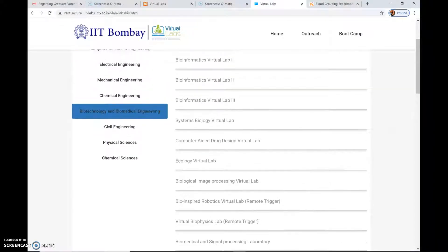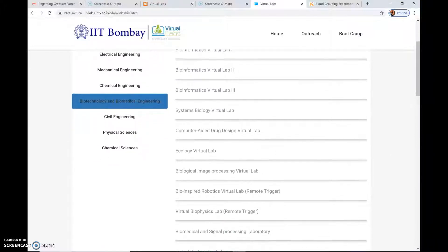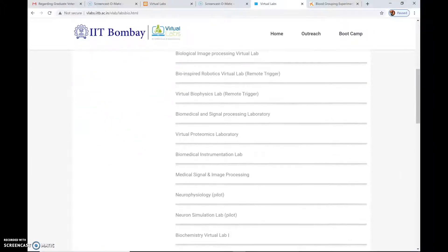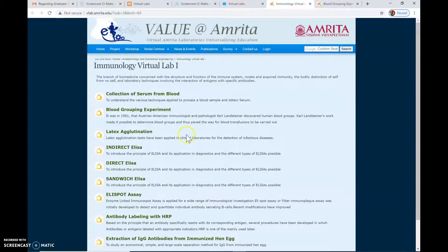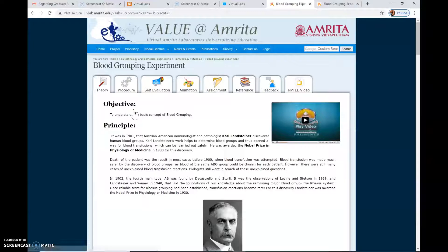which is Immunology Virtual Laboratory One. Click on this and you will see the experiment — Blood Grouping Experiment. Let's click on this. Now here is a virtual experiment regarding blood grouping.